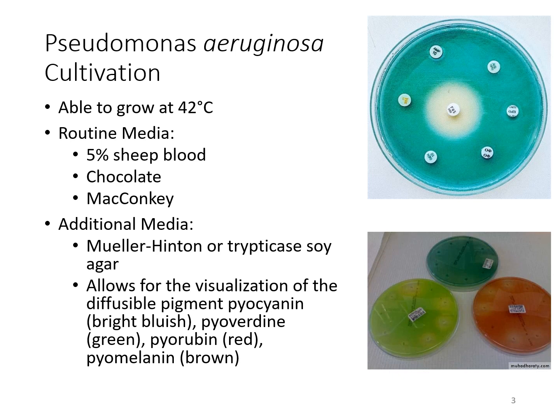So Mueller-Hinton agar is actually used to do antimicrobial sensitivity with those discs. So you see the antibiotic discs up here that are placed onto the agar. There's a special technique that the lab will use for these discs when determining if an antibiotic will work for a particular infection. Most labs do this automated now, but there are still some labs that do a manual method, especially with some of the rare antibiotics or older antibiotics.